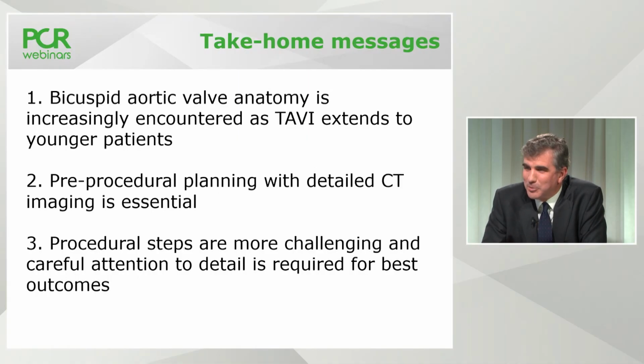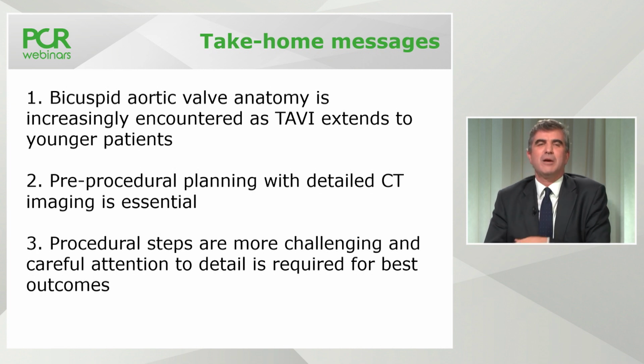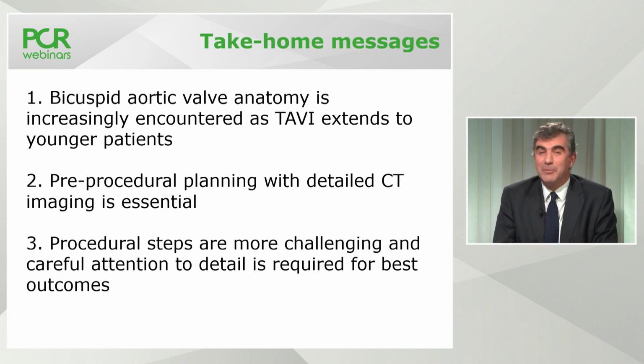So we're going to do a summary now in terms of the take-home messages of our discussions today. It's been very enjoyable talking to you both, and I've learned a lot as we've gone through the detailed structure of this webinar. The important point, firstly, to remember is that bicuspid aortic valve anatomy is coming your way, because this anatomical pattern is more and more common in younger patients, and is going to be very much part of our TAVI practice in the years to come. Maybe 10 or even 20% of our cases will have bicuspid aortic valves as time goes by.